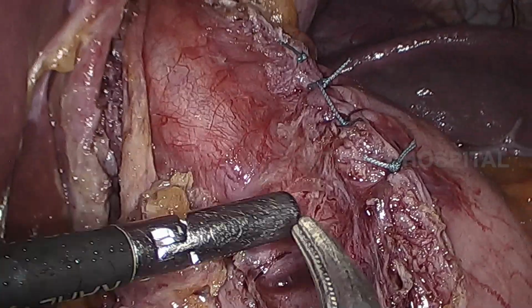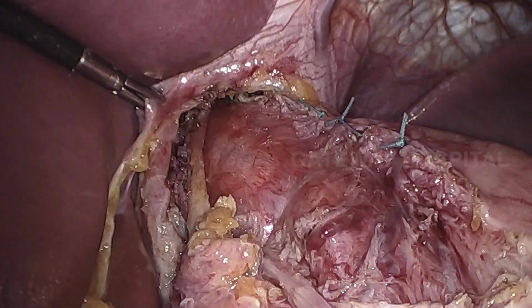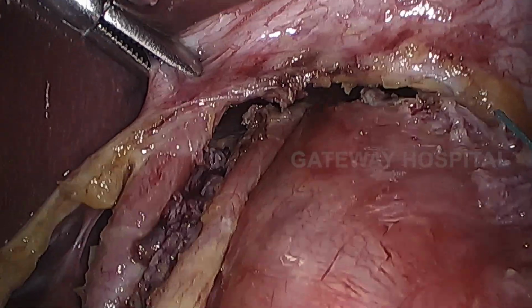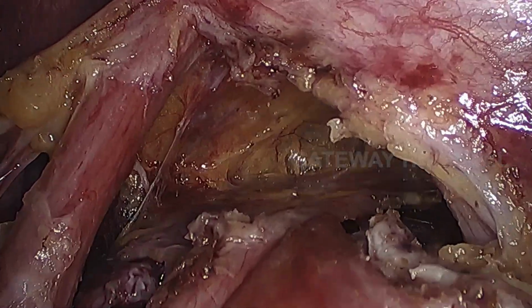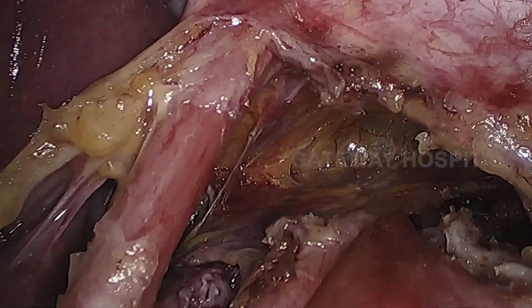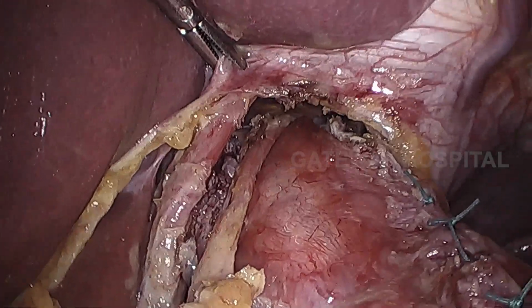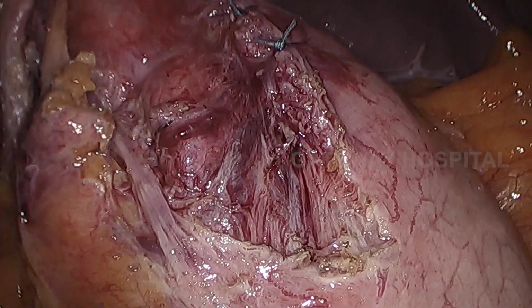So this is the completed laparoscopic Heller cardiomyotomy with posterior 270-degree Toupet fundoplication. This is the advantage of laparoscopy, where we can add an anti-reflux procedure. Thank you very much.